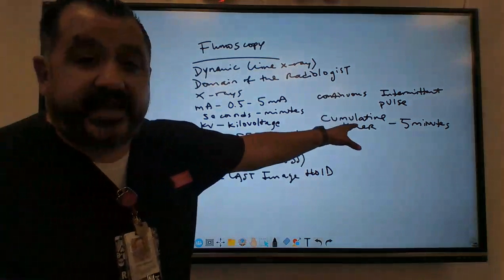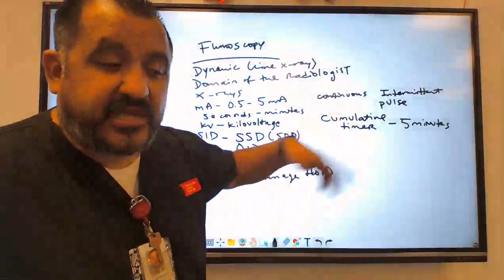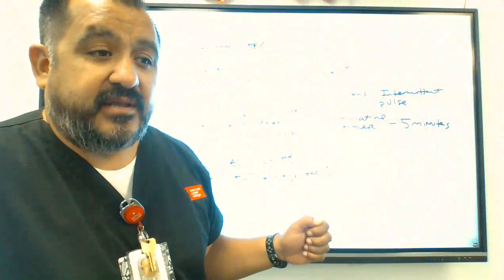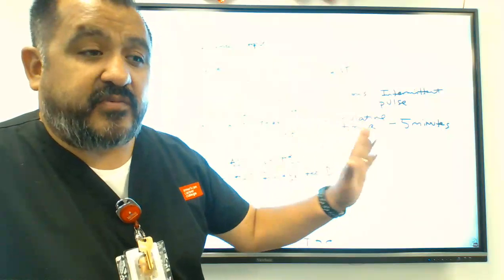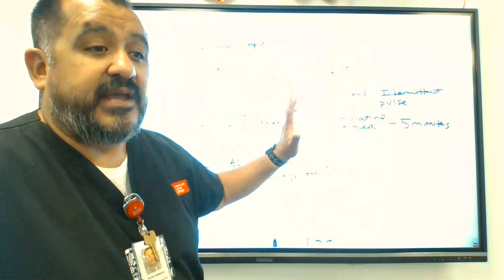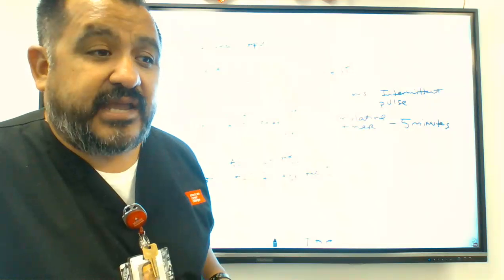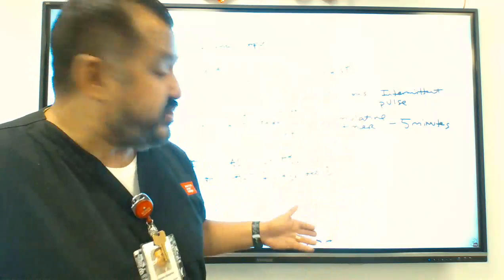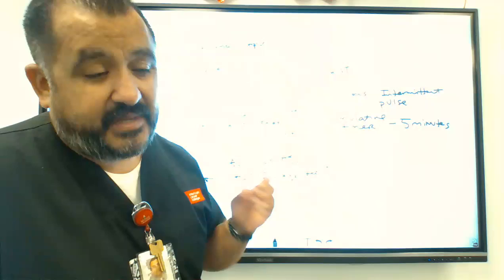Well, instead of letting the fluoroscopic X-ray exposure continue, you can go ahead and take a snapshot, right? You can take a picture of what we're doing or what we just did, and you can save it on the screen. And it's called last image hold. And the doctor can use that as a reference versus letting that fluoro run. So it actually helps to reduce time.